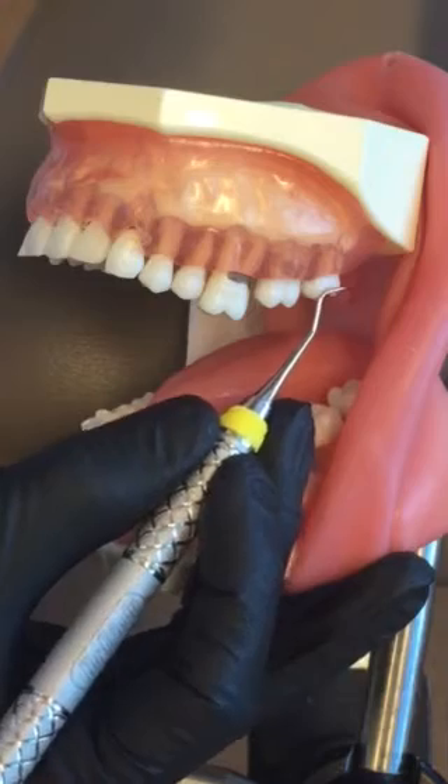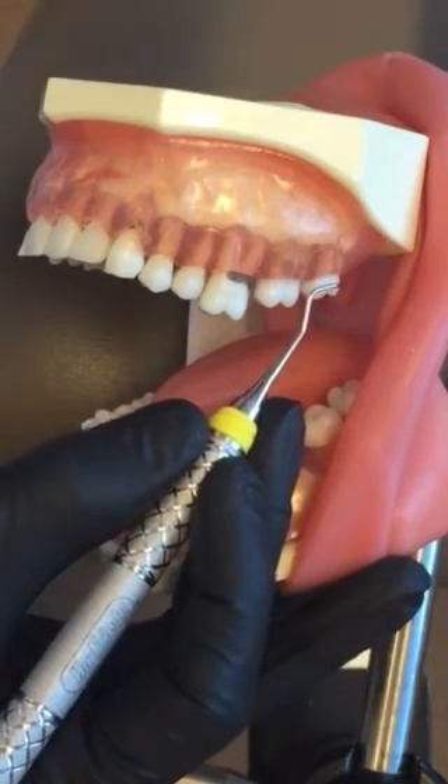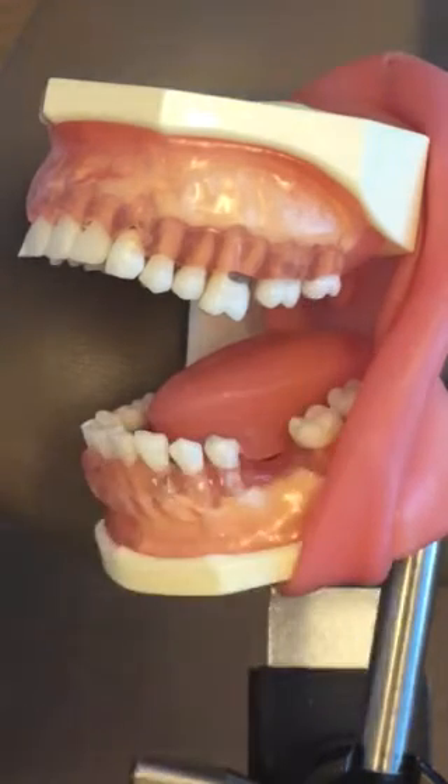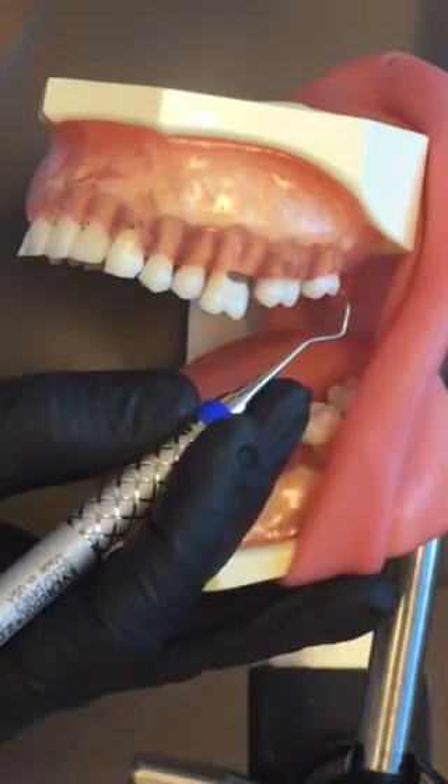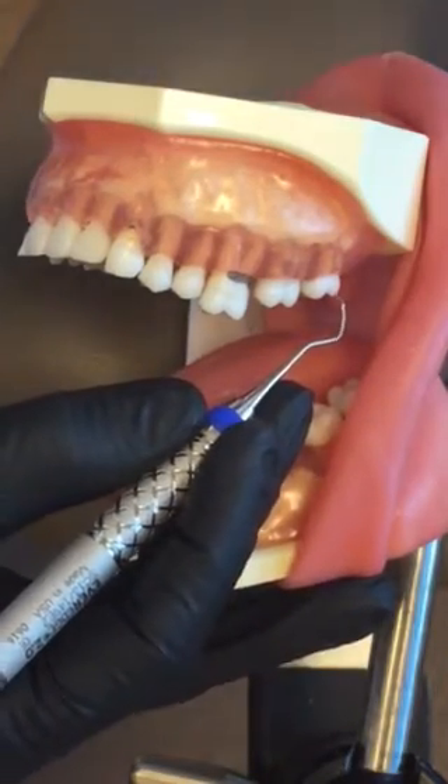I can tell that this end is not going to be parallel because the terminal shank is laying across the tooth. When I flip ends and establish the fulcrum I want to use, I can see that the terminal shank is now parallel.